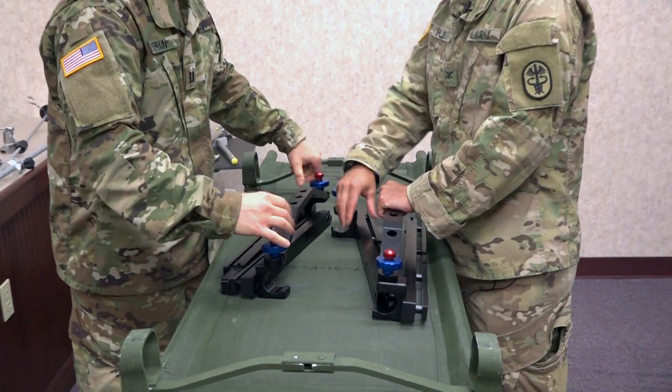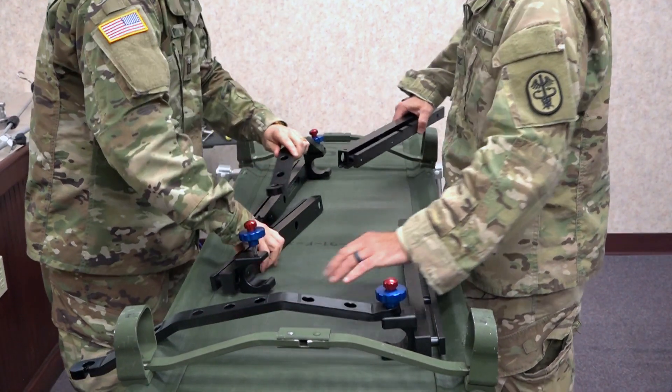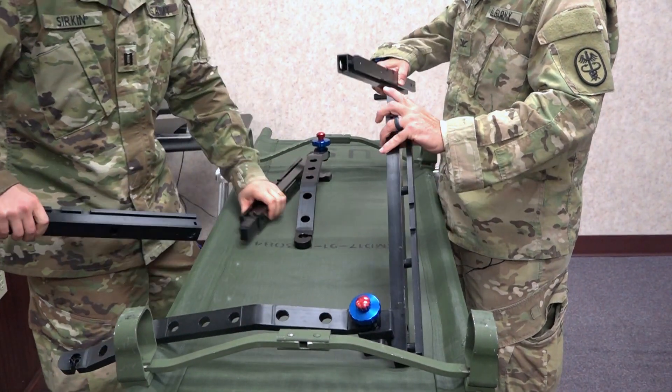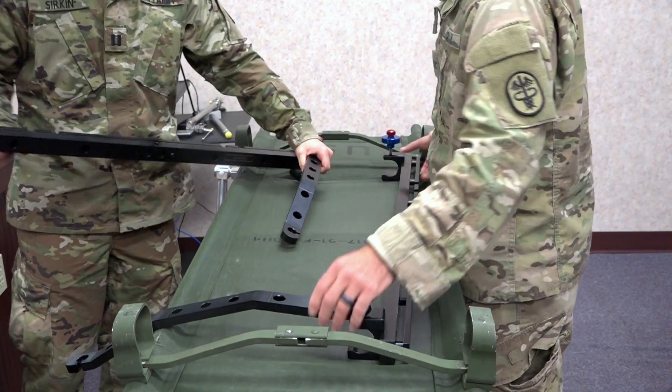First thing you're going to do is loosen the blue, and that's going to bring this assembly apart like that. Then we're going to put this male end into this female end until it clicks — just like such.